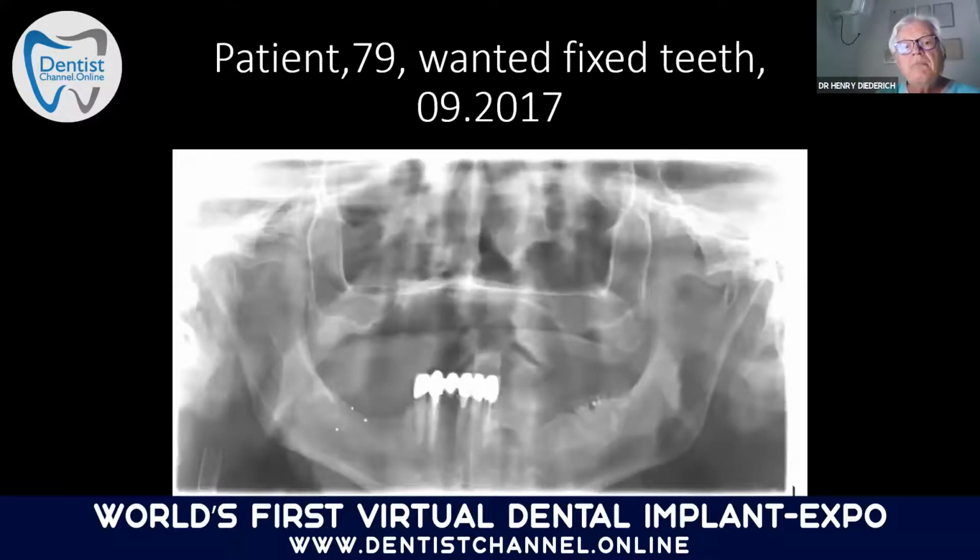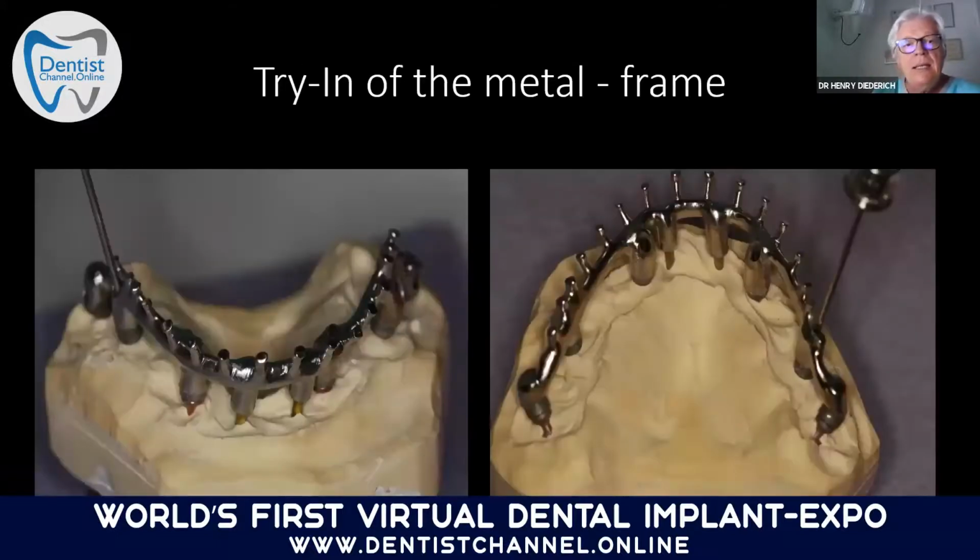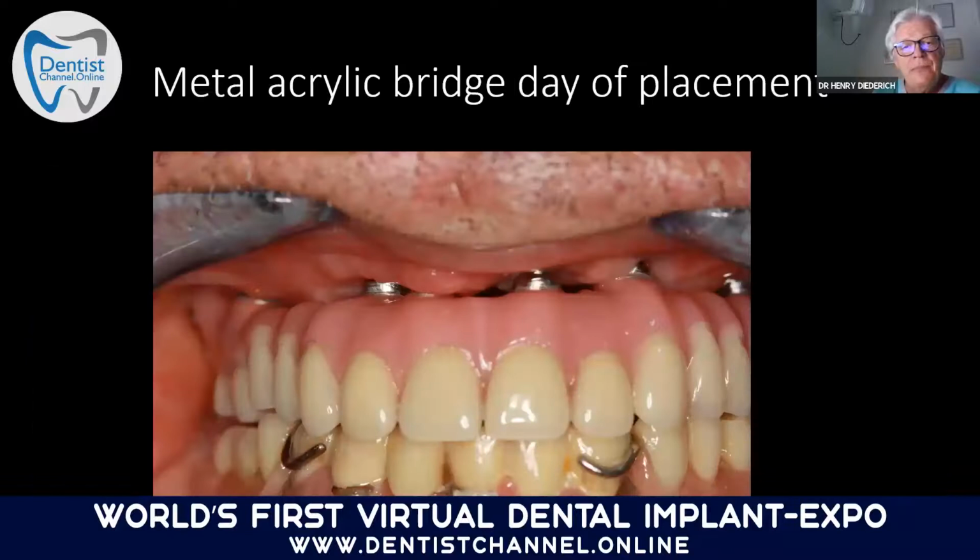Another patient, 79 years old. So, of course, when the patient is older and wants to have fixed teeth, the case was done in 2017. And then you see 2 weeks later, the placement of our bridge, and a happy patient because it was done in a very, very short and fast time. And here you see the structure. And here you see the prosthesis in the mouth. We keep space so that cleaning is possible. And here also it was done in metal acrylic because that was also a question of price.